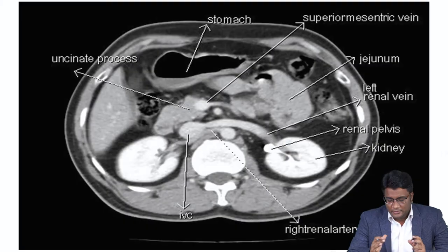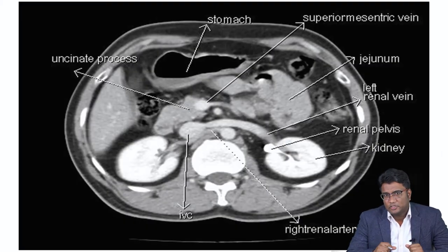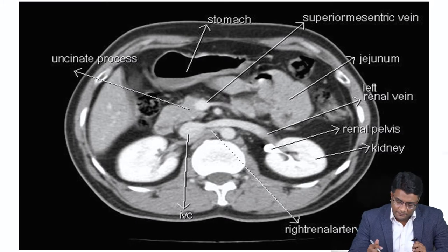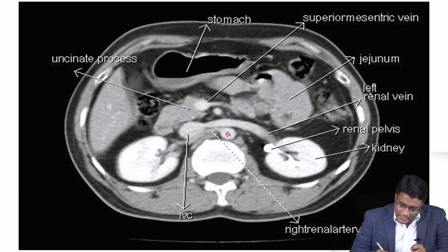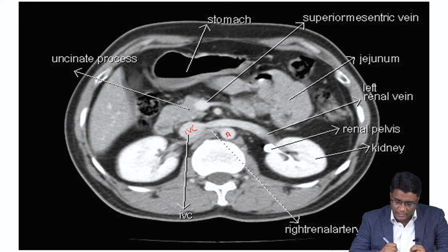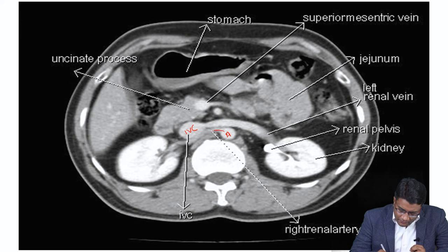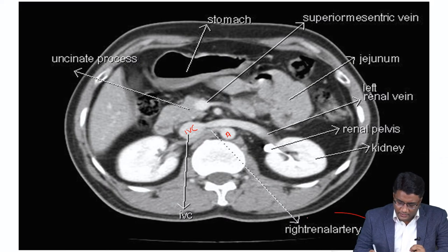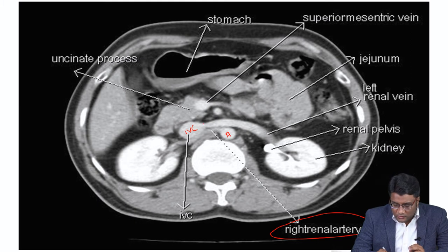Now let's try to understand the vessels in this image — please look at the image carefully. You can identify this is the aorta, and this structure here is the inferior vena cava. Just from the aorta going towards the right kidney, if you trace this carefully, this vessel coming from the aorta tracing towards the right kidney is your right renal artery.